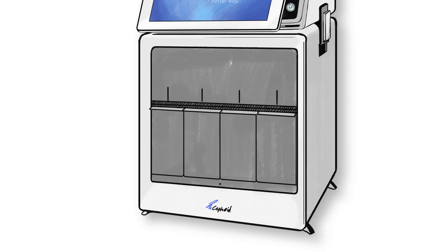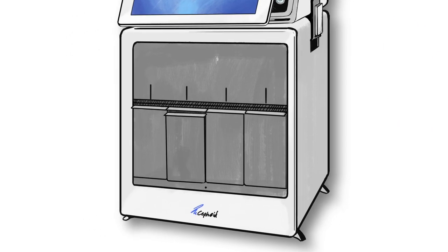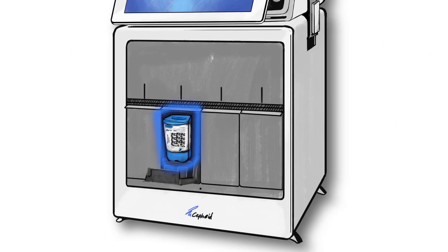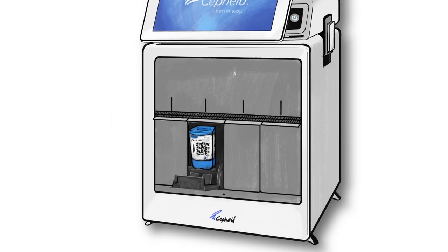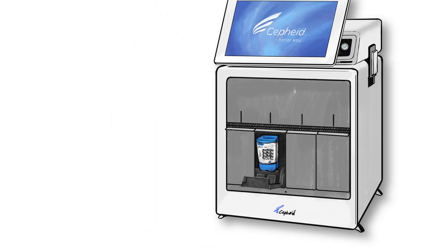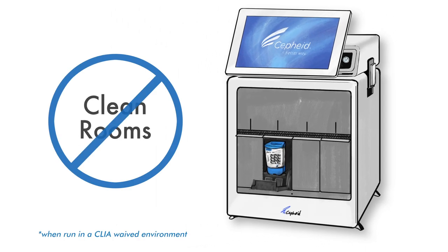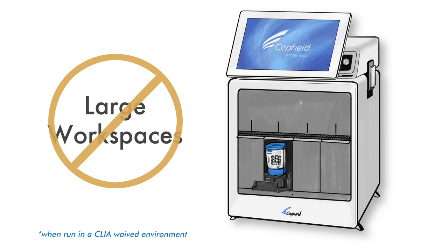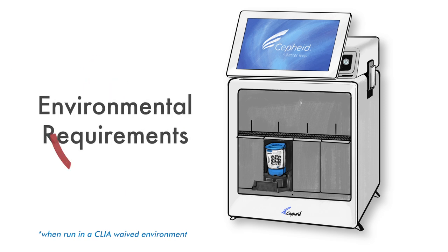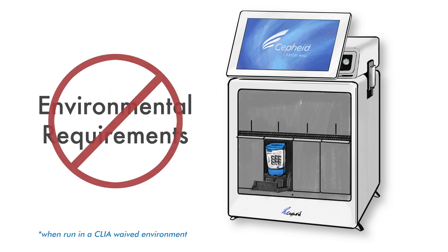So what's in the box? Cepheid's tech packages an entire molecular lab into a compact self-contained cartridge which completely eliminates the need for clean rooms, large workspaces, or specialized environmental requirements.